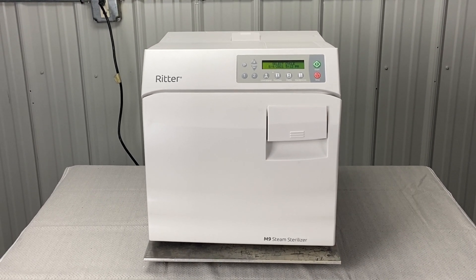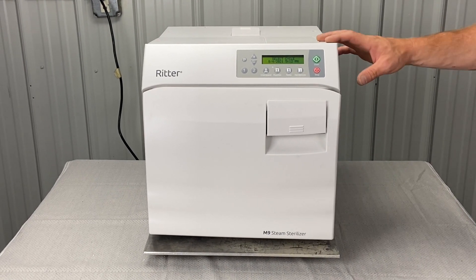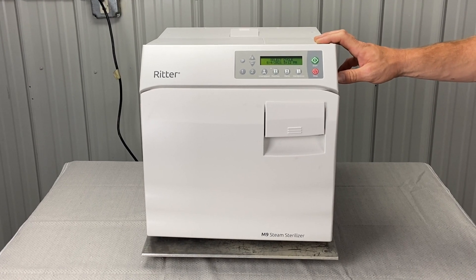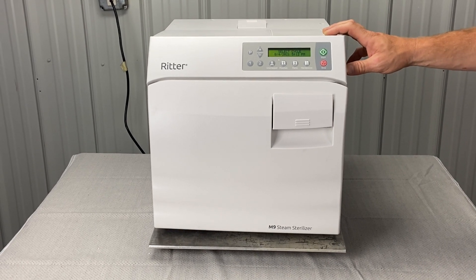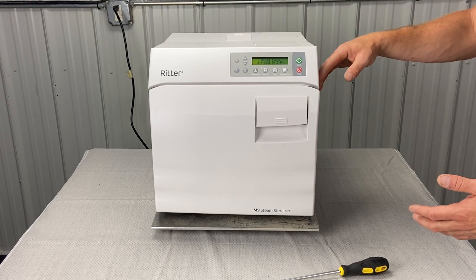In our Midmark troubleshooting videos, we tell you to take the side panel off quite a bit — when we're inspecting for leaks, burnt wiring, or PC board malfunctions, and so on. So to take off the right side panel, here's what you'll do.